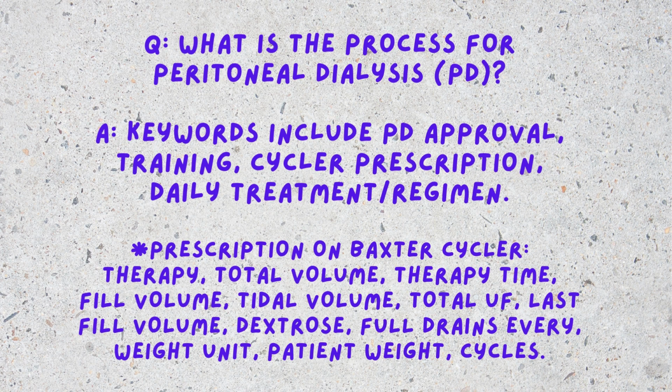Then she is going to make some home visits too once your supplies arrive to help you set up how to connect your machine, disconnect, break it down, dispose of the fluid when you are done, and all that. So she's just there as your point of contact in order to set you up for success in the initial stages, and also be there for you as you navigate this process.